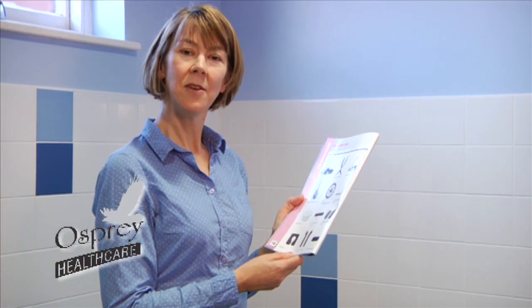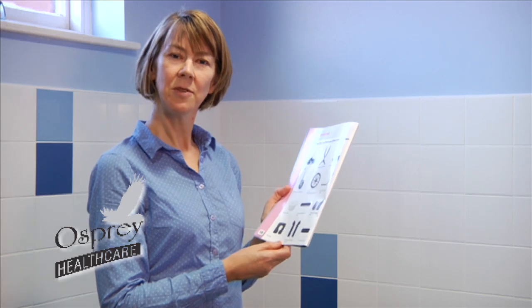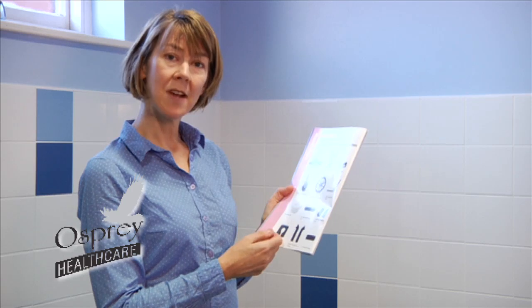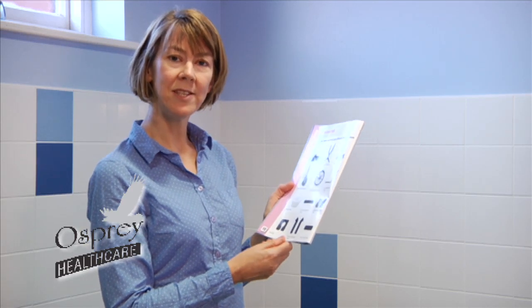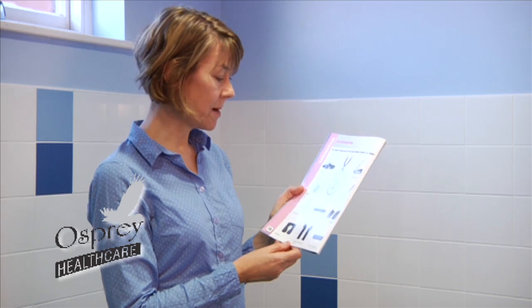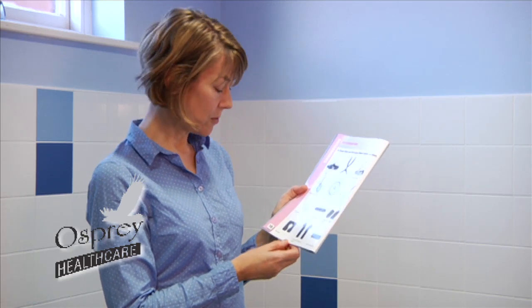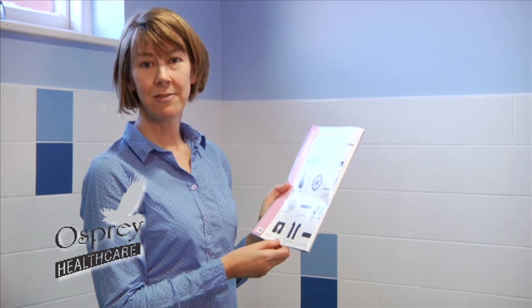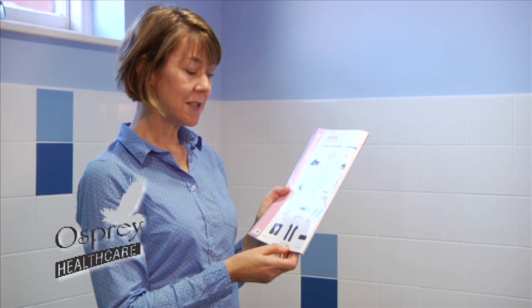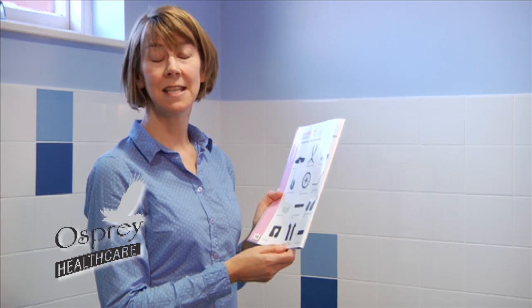Just to summarise, we've had a look at the Osprey Healthcare shower, toilet, and commode chairs. The different options available with this range include lap straps, different ranges of harnesses and wedges to provide postural control and support, self-propelling or castor-type wheels, commode pans or over-the-toilet options, and a variety of different gel pads. If you're interested, the best thing to do is ask Osprey Healthcare or one of their network of dealers to come and assess the individual client.